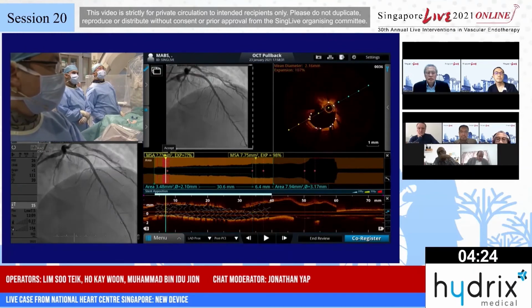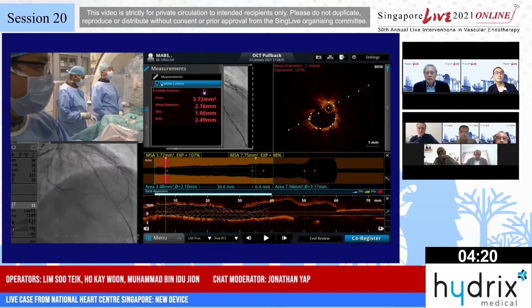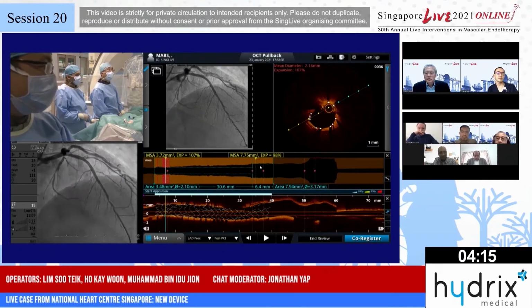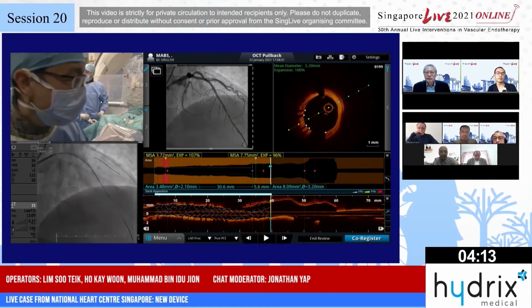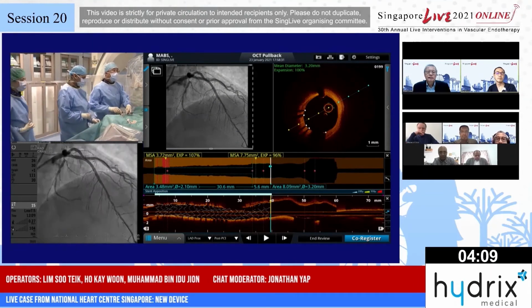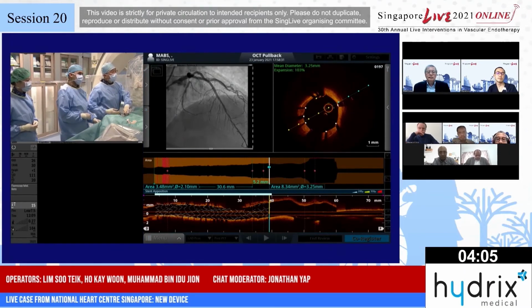What do the panel think? I think it's a very nice result that you have there. Criteria of adequately expanded stent.